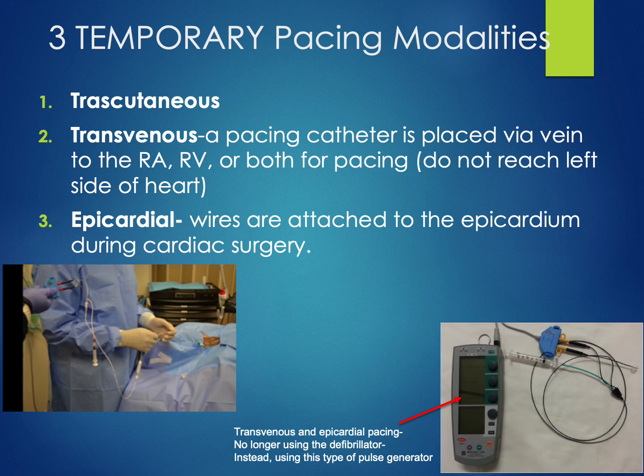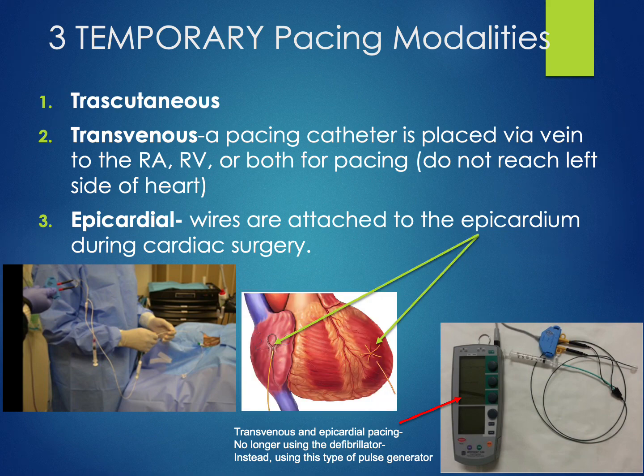So this sounds a lot more direct, right? Well, it definitely is, and it often requires less electricity and is more comfortable for the patient since we're closer to the heart. Now, our last temporary pacing modality is epicardial pacing.